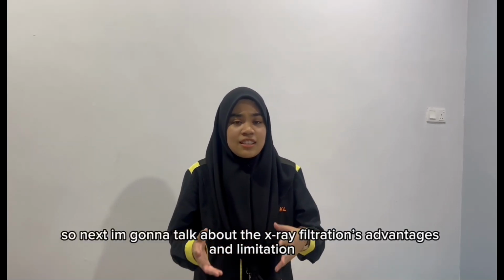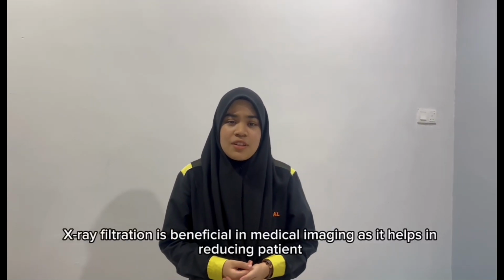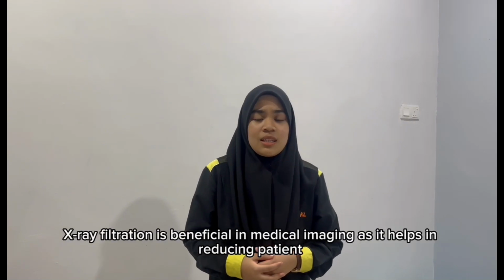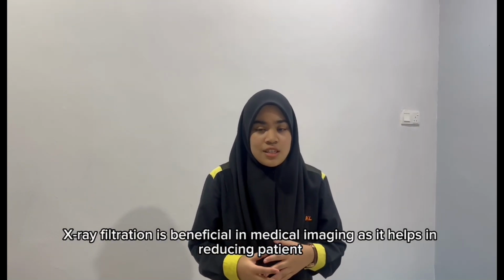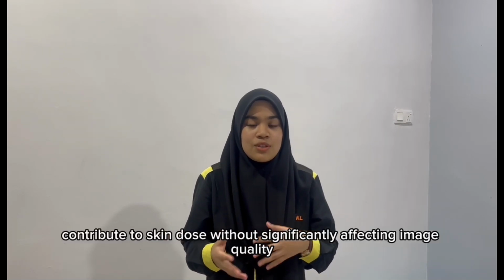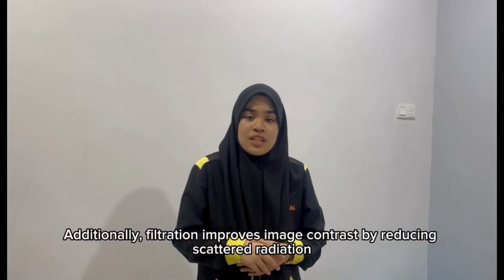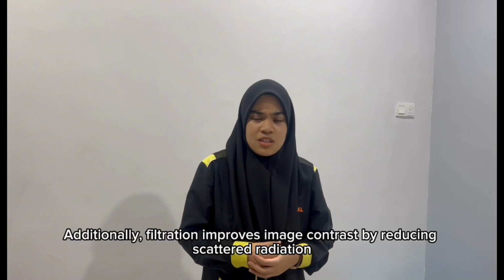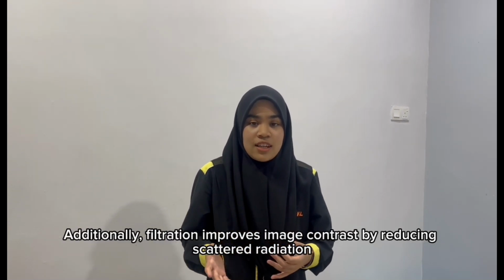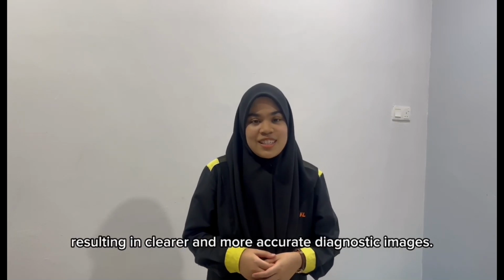Thank you. So next, I'm going to talk about X-ray filtration advantages and limitations. X-ray filtration is beneficial in medical imaging as it helps in reducing patient dose by removing low energy X-rays that contribute to skin dose without significantly affecting image quality. Additionally, filtration improves image contrast by reducing scattered radiation, resulting in a clearer and more accurate diagnostic image.